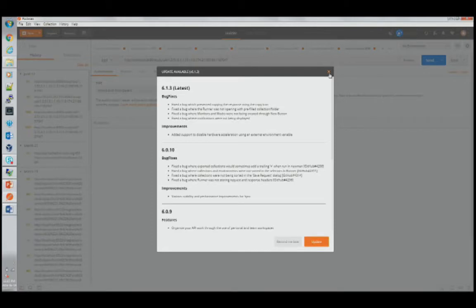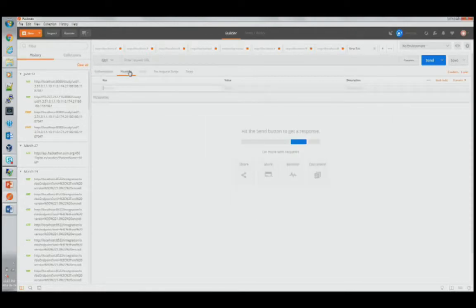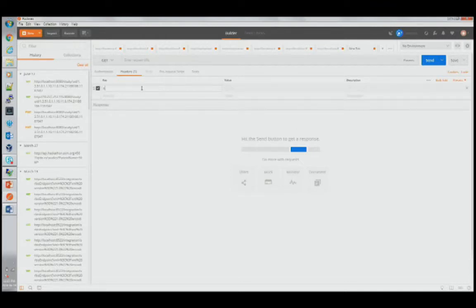So let me just use Postman. I assume most people here are familiar with Postman, the concept. Perfect. Lovely. Okay, so let me put an API key in my header, and then we'll make some DICOM web requests. All right.